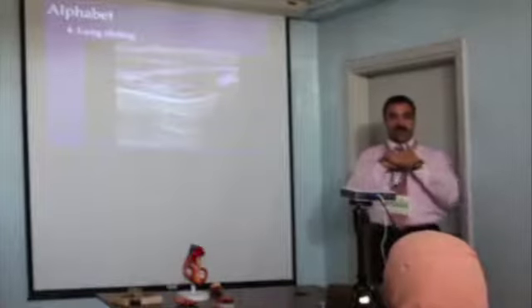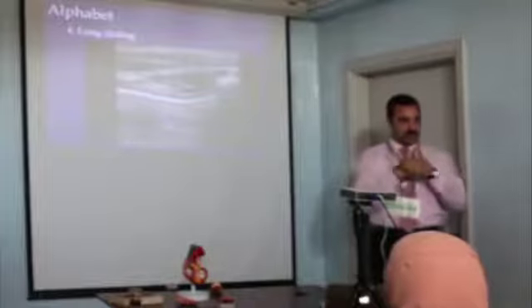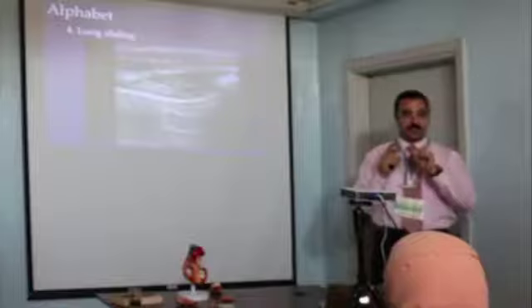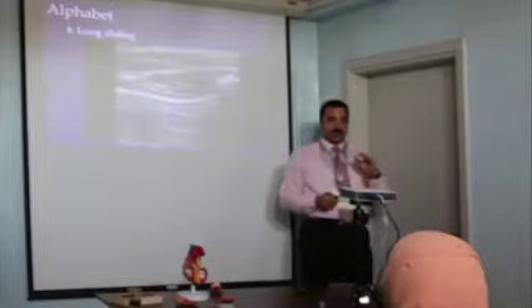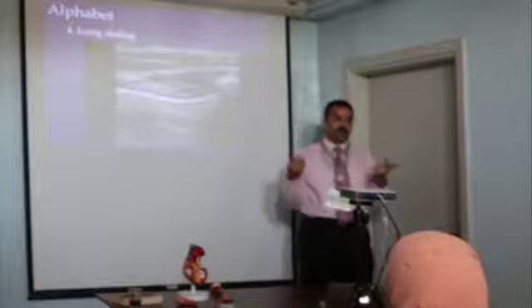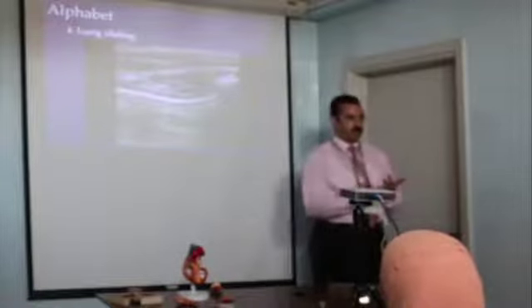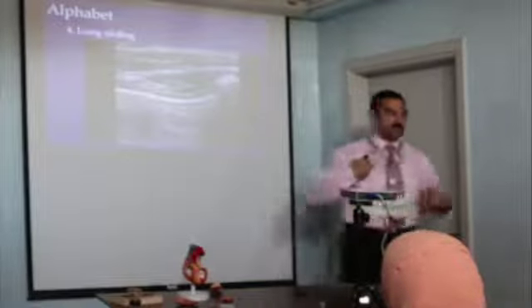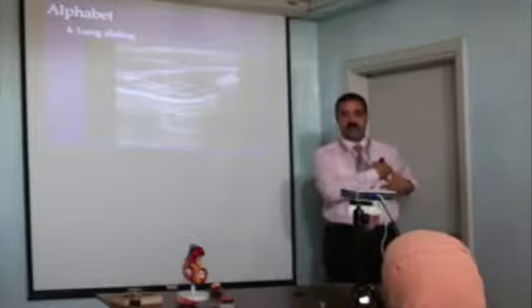Okay? So if there is no sliding, that means there is a problem between parietal and visceral pleura, and take that cautiously. It does not mean pneumothorax. We'll come to this one. Yeah. So if there is no sliding, it could be pneumothorax? Yes. Could be atelectasis? Yes, because there is no sliding. Could be pneumonia, COPD, could be an apneic patient, could be a right mainstem bronchus intubation and you are scanning the left. That means there's no inflation or proper inflation of this lung.